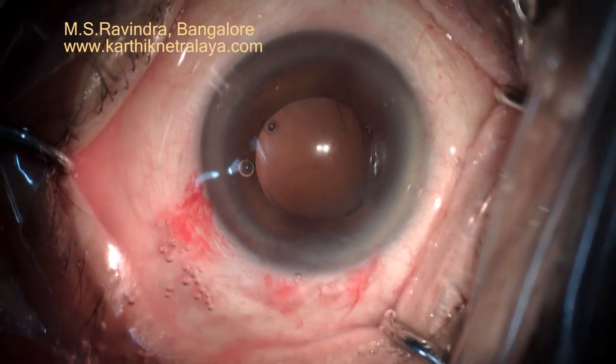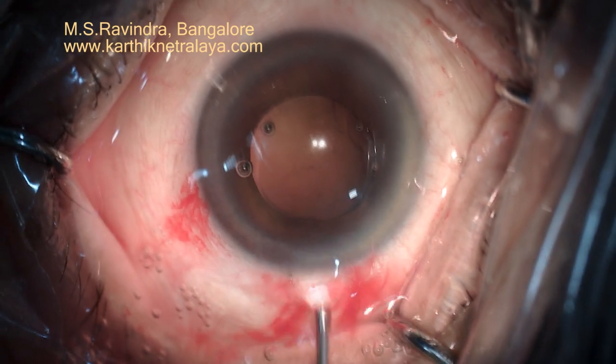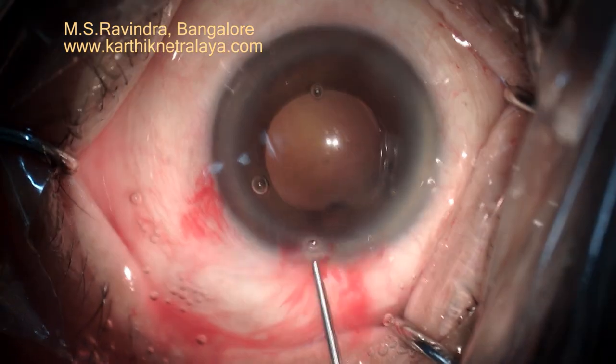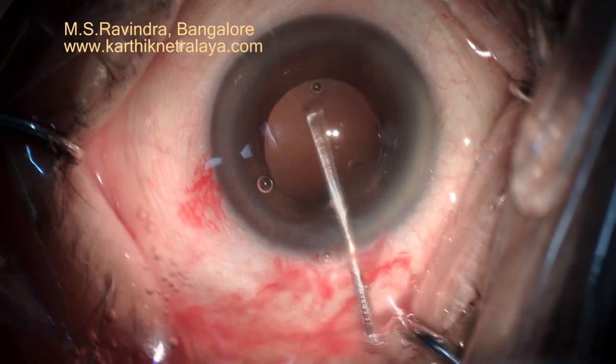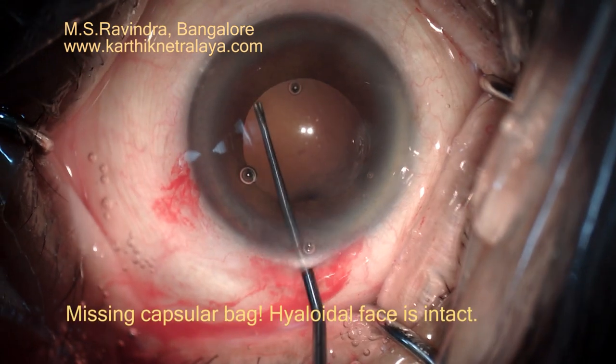I filled the chamber. There is no vitreous in the entry chamber and the pupil. I tried to pull the iris out to see if there is a capsule, which can be identified by the rhexis margin. To my horror, I don't see any capsular bag or rhexis margin.